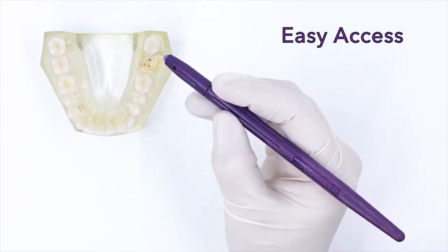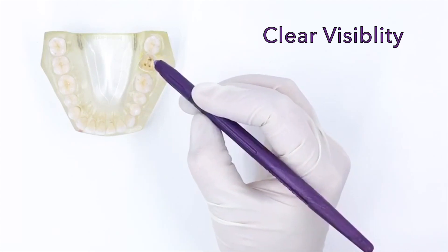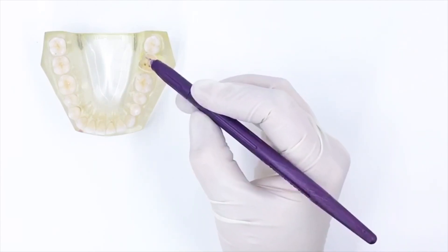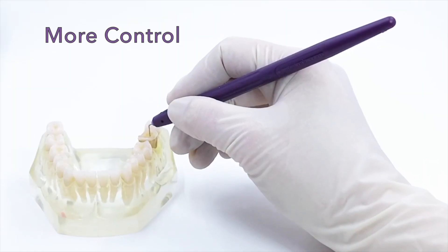This allows easy access and a clear view for finding canals faster. A pen grasp grip gives you better leverage and more control.